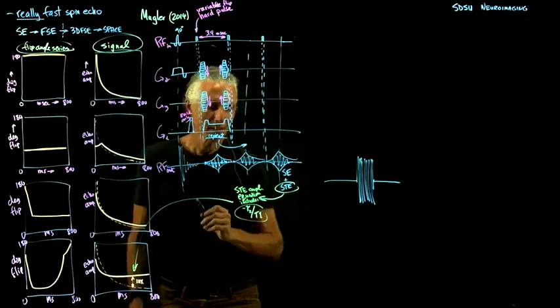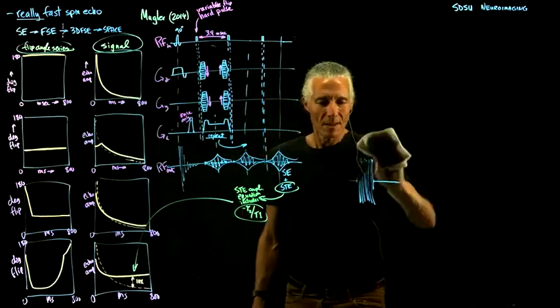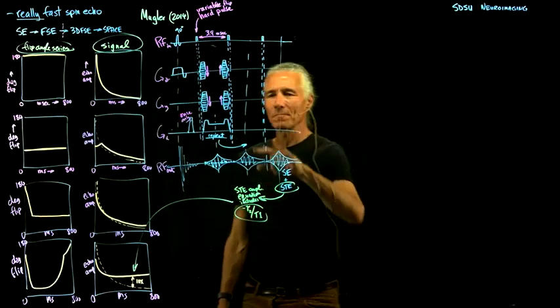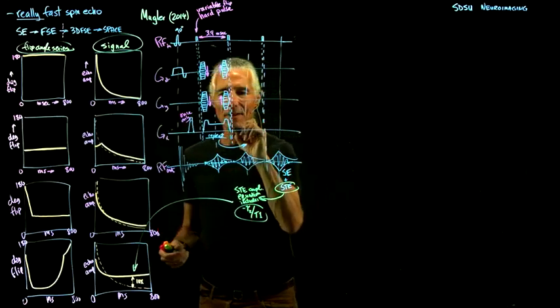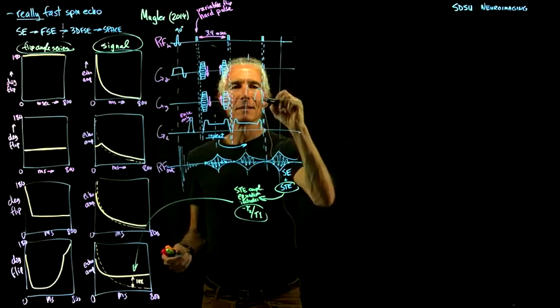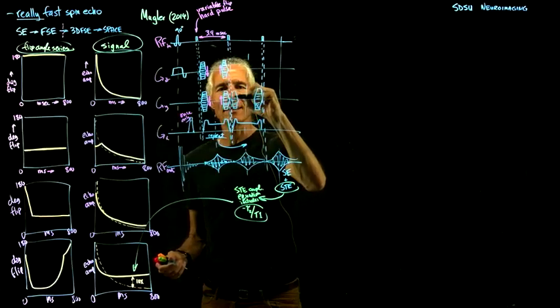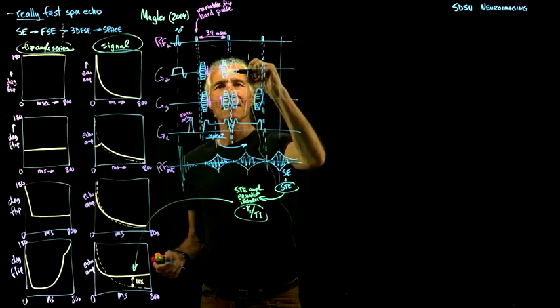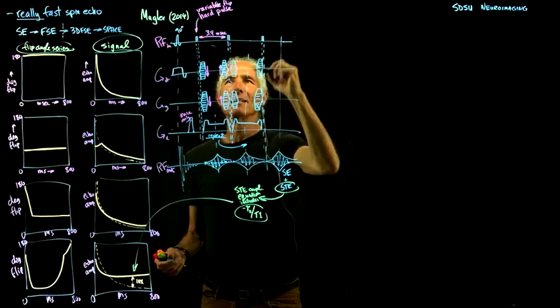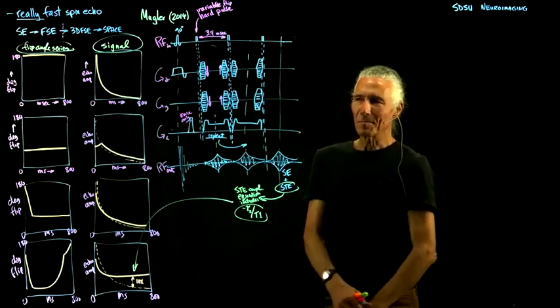It includes that, and so that's a good thing. So that means that it doesn't decay very fast. So that's why we can end up with an echo after 800 milliseconds. So you can see it's a very simple looking pulse sequence. I'll just draw one more repeat in here. So the gradients are hammering back and forth, and the flip angles are not too big. We're not heating up the subject too much. So we're going at least twice as fast as we were before, but it still wasn't quite fast enough.